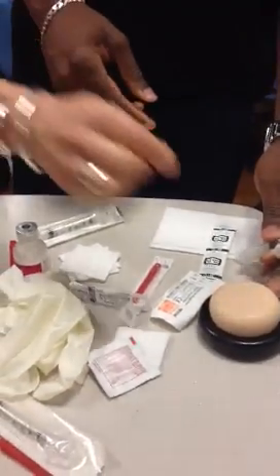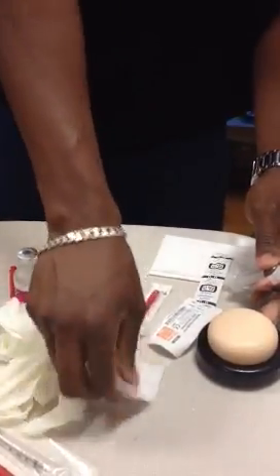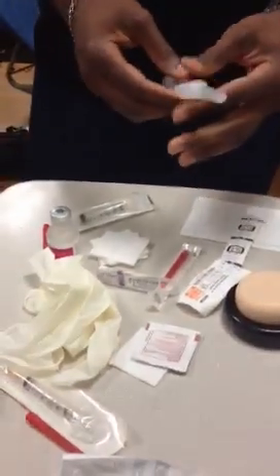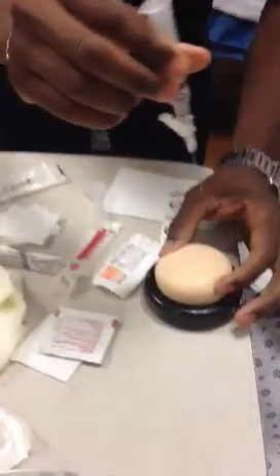So then I'm gonna switch out. I'm going to throw this in the sharps bin. And I'm going to swab the site. Now, how many times do you go around? You go in the inside, around, and out. Give it to Professor Carr. 3 times. That's fine. If it was a PPD, I'd let you give it. That's the only injections I accept. Okay, I'm gonna go at 90 degrees.